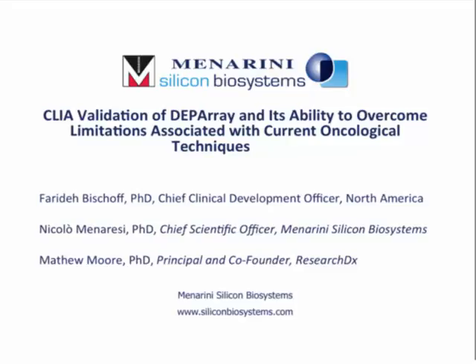Go ahead, Matt. Do you want to comment on the reproducibility? Yes, I do actually. We exchanged the samples before the validation, as you remember. So to answer your question, I can't comment in terms of between labs, but certainly in my own lab, there are 2 sorts of repeatability and reproducibility that we've performed. If you look at multiple CTCs in the same run, you will see the same genetic profile in all of those CTCs every single time. There are cases that may have 2 independent clones, and then if you run multiple CTCs, you'll see multiple copies of 2 distinct clonal populations.